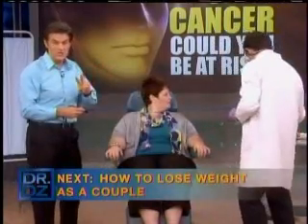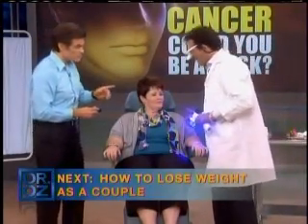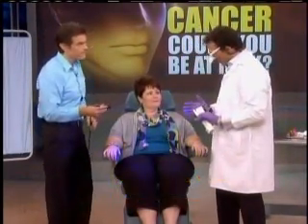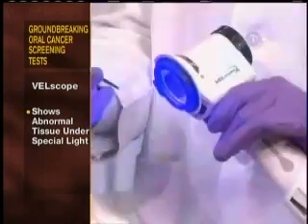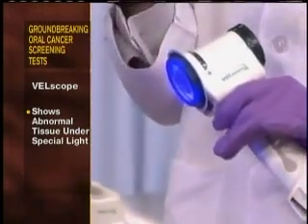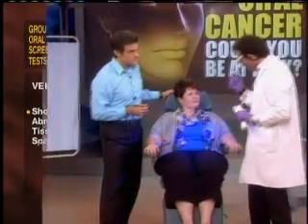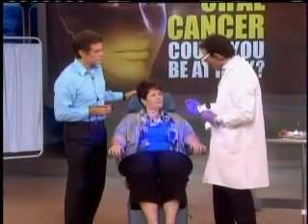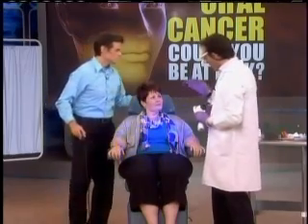Okay, talk to me about the Velscope. We've got two technologies that are changing dramatically how we can quickly screen and identify cancers. This thing is really cool. So the Velscope is a new technology, and it's a visualization tool, and it allows us to see the normal tissue and compare it if there's any abnormal cells. And it will highlight these abnormal cells early when it's dysplastic changes.